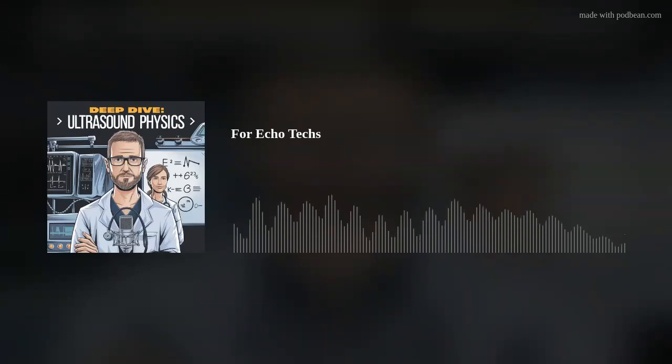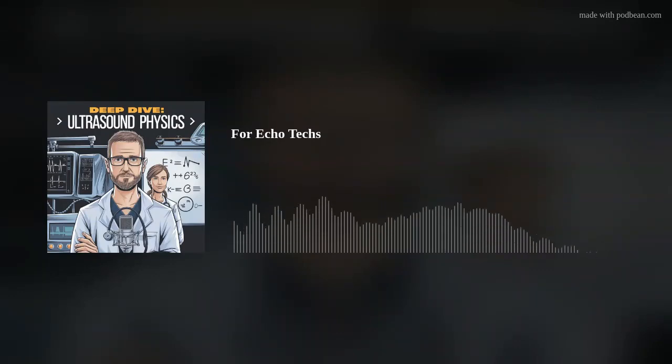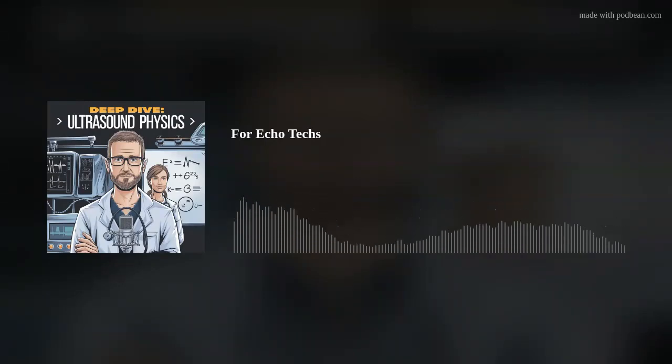There's 3D echocardiography. Instead of flat 2D images, we can create a three-dimensional model of the heart. Wow. It's like going from a flat map to a 3D globe. That's a great analogy. It's a game changer for visualization, especially for surgeons. Oh, I can imagine. They can see the heart from every angle. Exactly, and plan procedures with much more precision. Incredible. So what else is there?